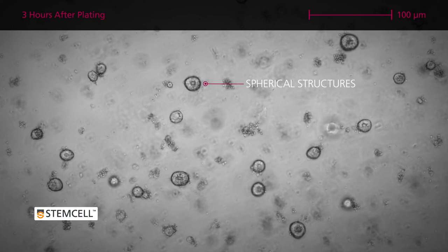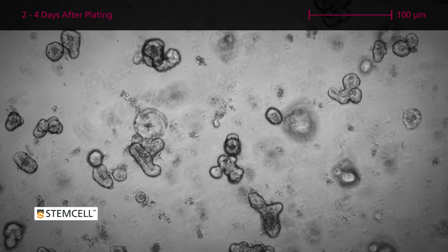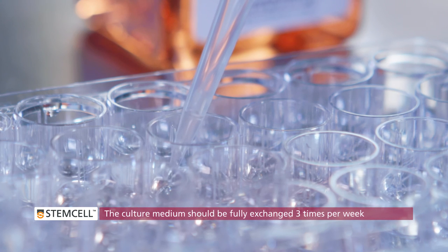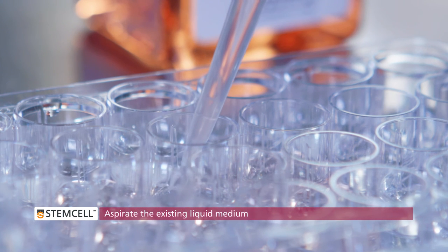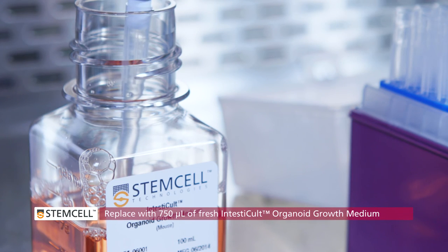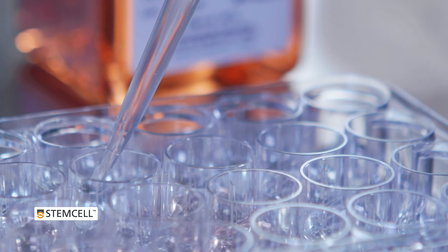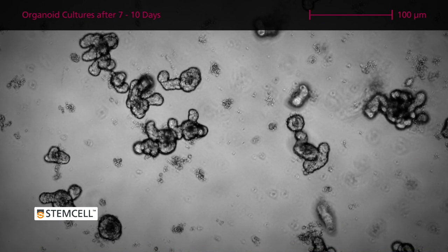Typically, the crypts form spherical structures about three hours after plating and begin to bud after two to four days in culture. The culture medium should be fully exchanged three times per week. Aspirate the existing liquid medium, keeping the pipette tip at the edge of the well bottom. Replace with 750 µL of fresh, room temperature intestinal organoid growth medium. After seven to ten days, the organoid cultures are fully mature and ready for passaging.